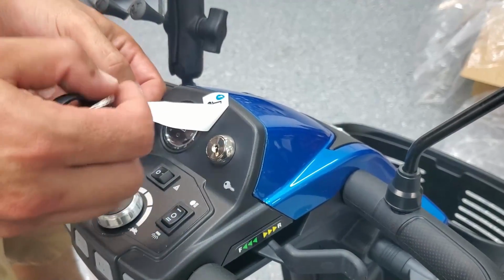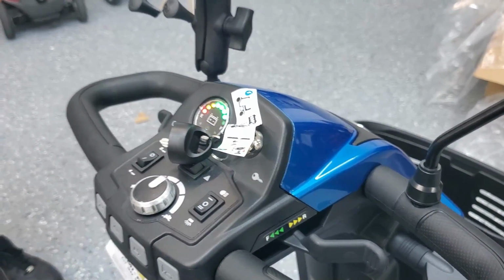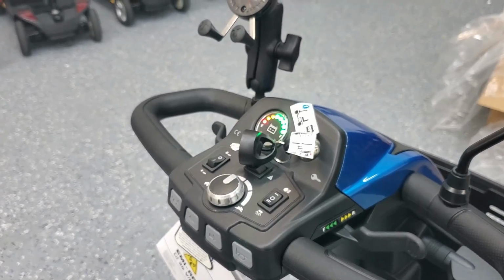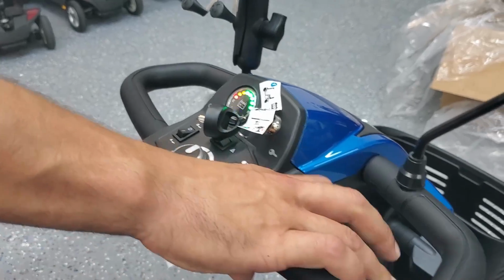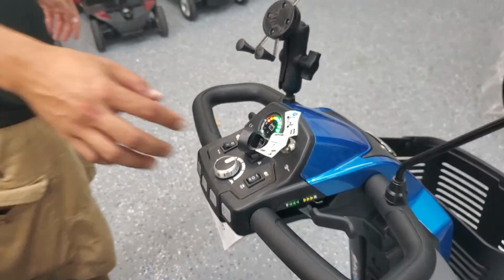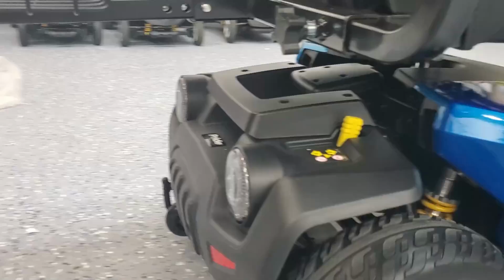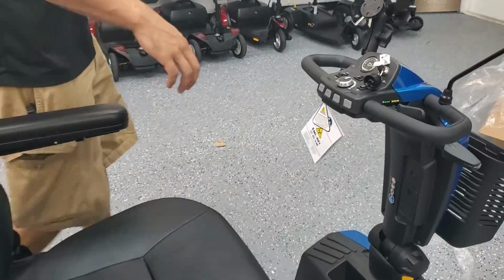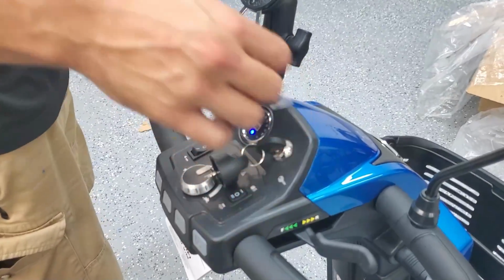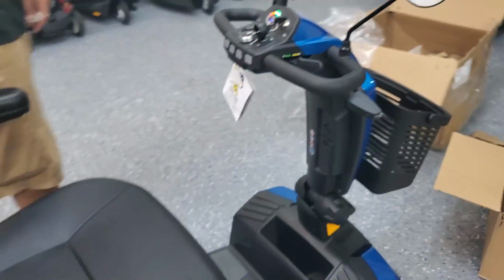And you're probably going to hear a beeping noise because if you remember, when we turned the scooter on earlier, we put it into freewheel mode, which it's currently in. So the scooter won't move. Why? Because it's in freewheel mode. So what you do is you turn it off, go back to the lever earlier, which we put into freewheel mode. That's why I can pull it and push it. And it won't work in that mode. So I put it back into drive mode. I'm going to turn the unit back on, and now it moves, just as intended.